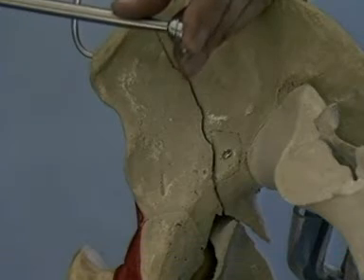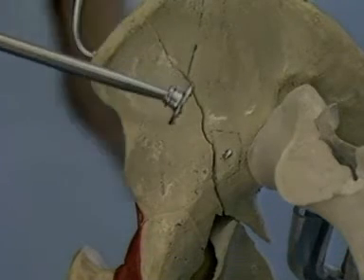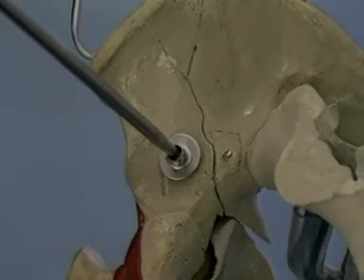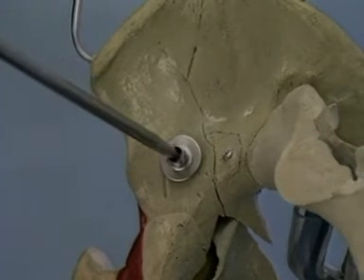A spiked disc can be attached to the tip of the ball spike or other ball-tipped pelvic reduction instruments to prevent penetration in osteoporotic bone.